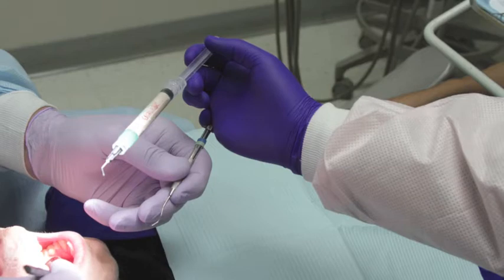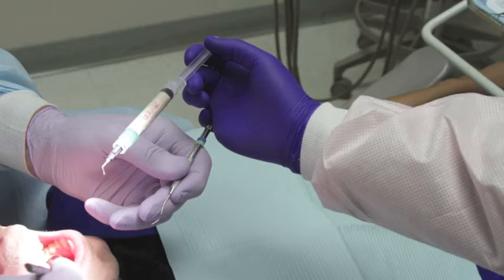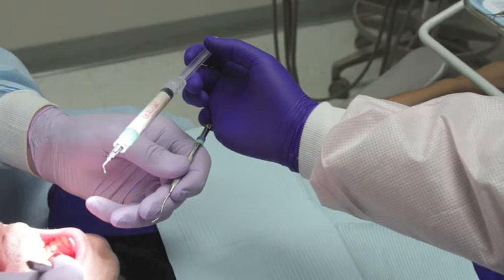In the next several clips, you're going to see a variety of instruments being transferred from several different angles. Notice as you look that the techniques will remain essentially the same no matter what we're passing, whether it be an instrument, or a syringe, an etchant syringe, or a little brush. It doesn't really matter.